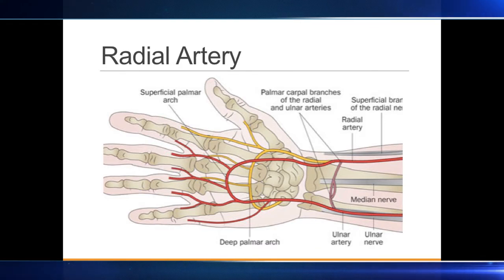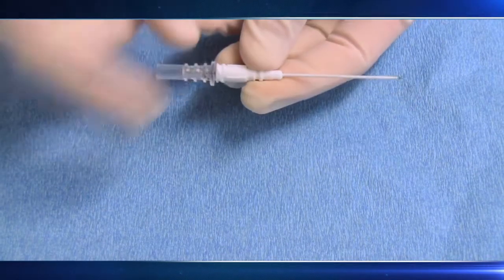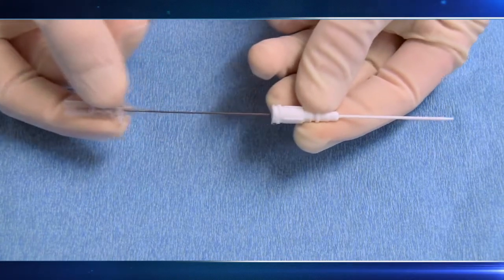The equipment needed for the procedure will depend on which anatomic site is chosen. The radial artery is preferred given the dual blood supply to the hand. When radial artery cannulation is not possible, different equipment is needed for femoral artery catheterization. For radial artery catheterization, 3 techniques may be used. The first is the catheter over needle technique.